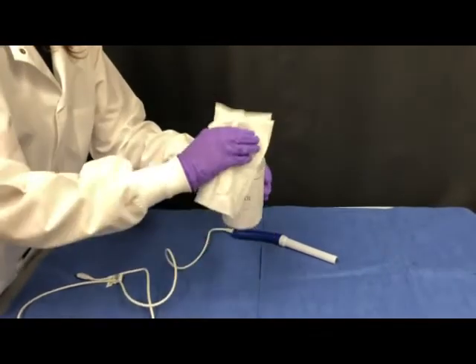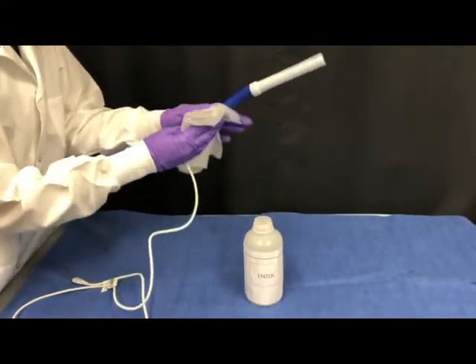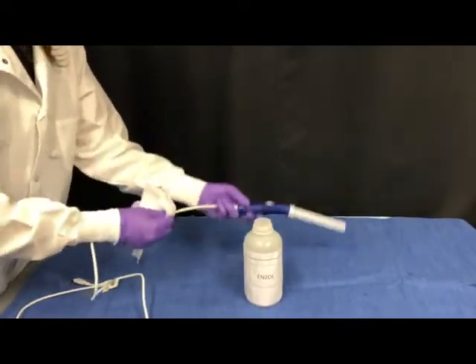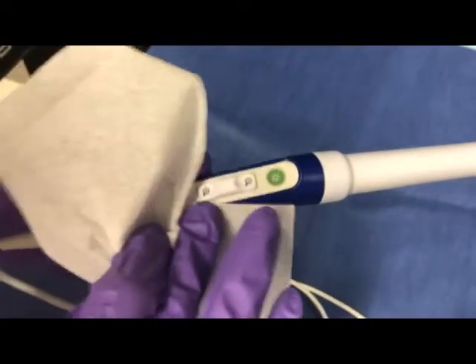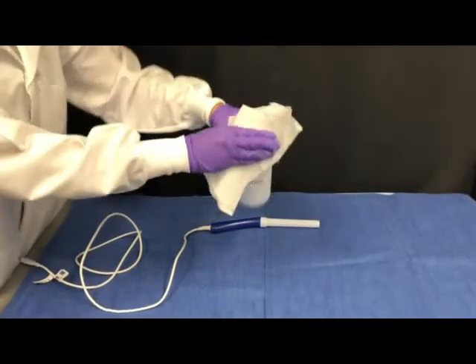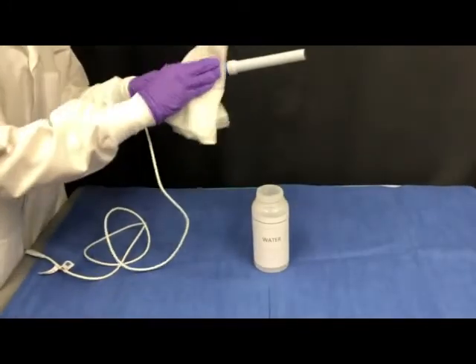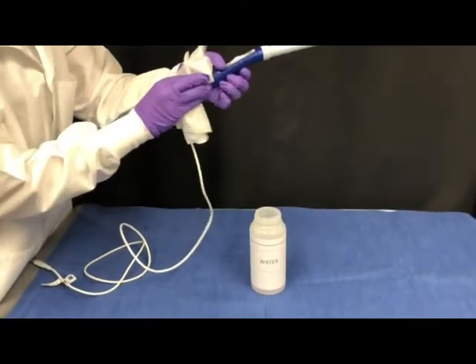Evenly dampen a clean, lint-free cloth with the enzymatic detergent and thoroughly wipe down all surfaces on the cord and handle. Pay special attention to the crevices around the buttons and the focus slider. Then evenly dampen a clean, lint-free cloth with sterile water. Wipe the cord and handle. While you are cleaning the device, avoid letting liquid pool on the cord or the handle.